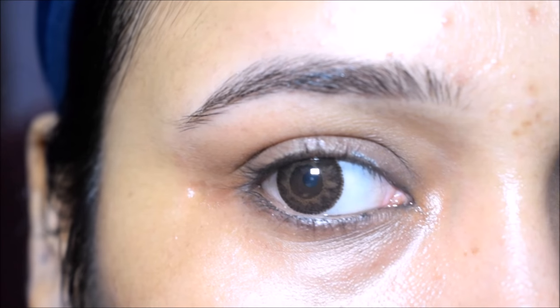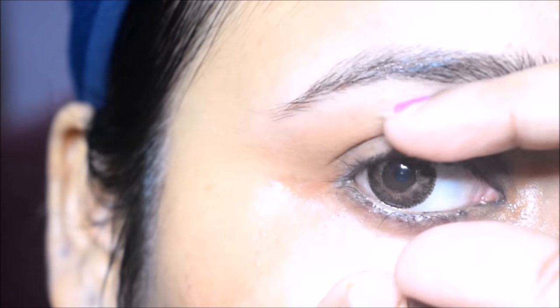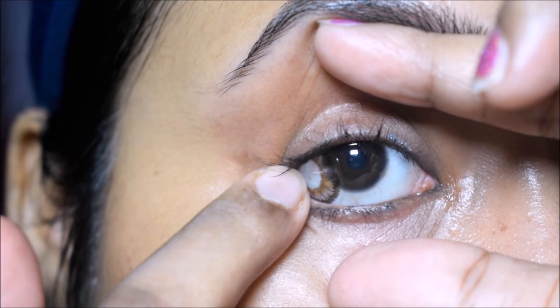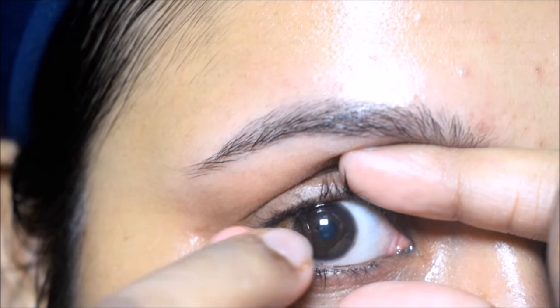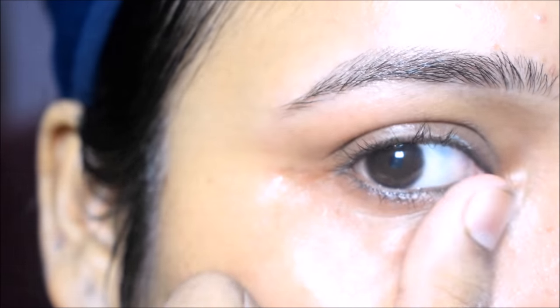For removing the lens, wash your hands properly and stretch your eyes. After stretching your eyes, drag your finger to the middle of the lens. You will see that it comes off. You can remove the lens like this.